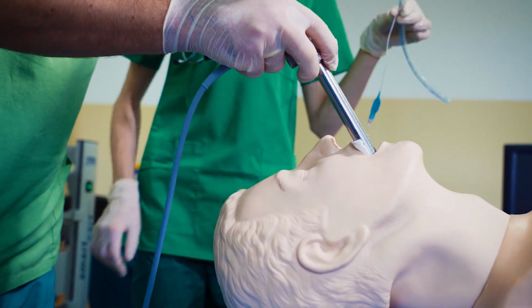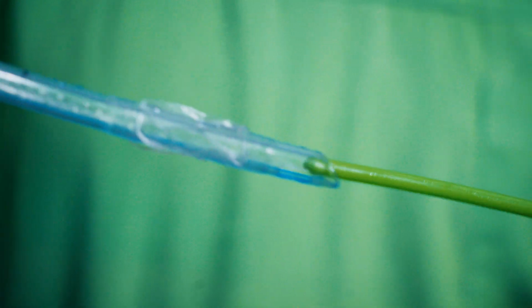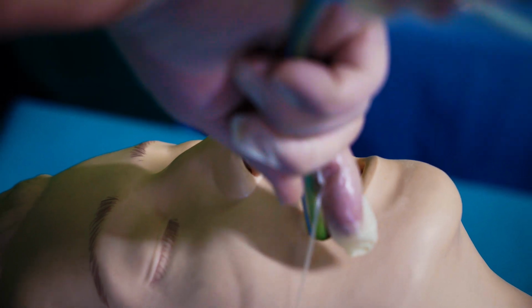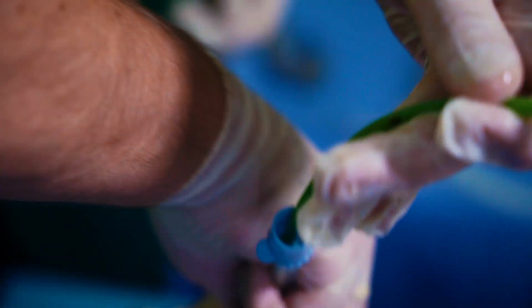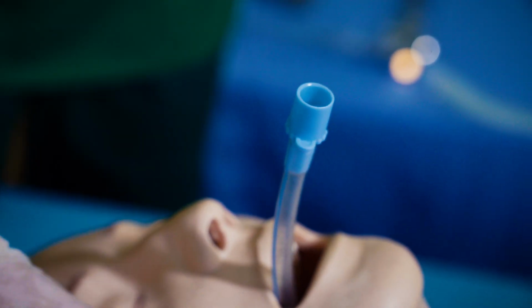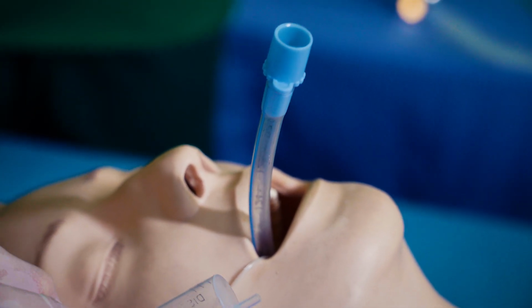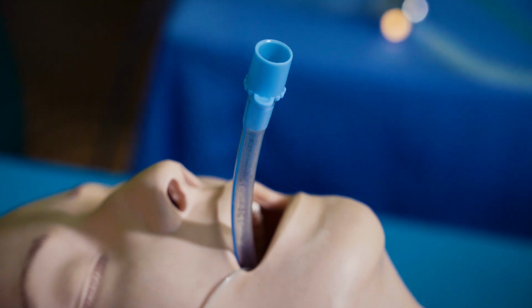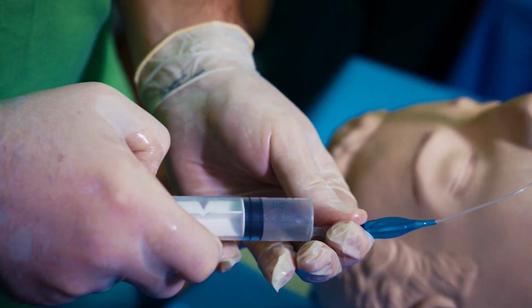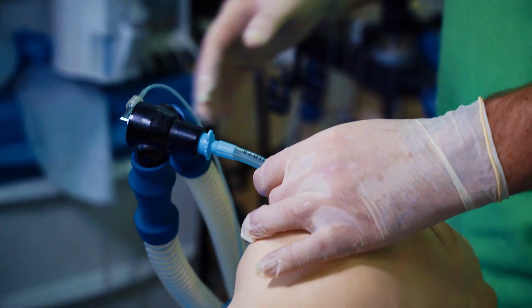Extract the rigid tube. Place a standard cuff lubricated intubating tube over the introducer into the trachea. Do not use force and gently rotate the intubating tube while advancing. Once the intubating tube is at the proper depth of 20 to 25 centimeters from the labial commissure, remove the intubating tube introducer, leaving the intubating tube in place. Inflate the cuff and confirm tracheal intubation through lung auscultation and capnography.